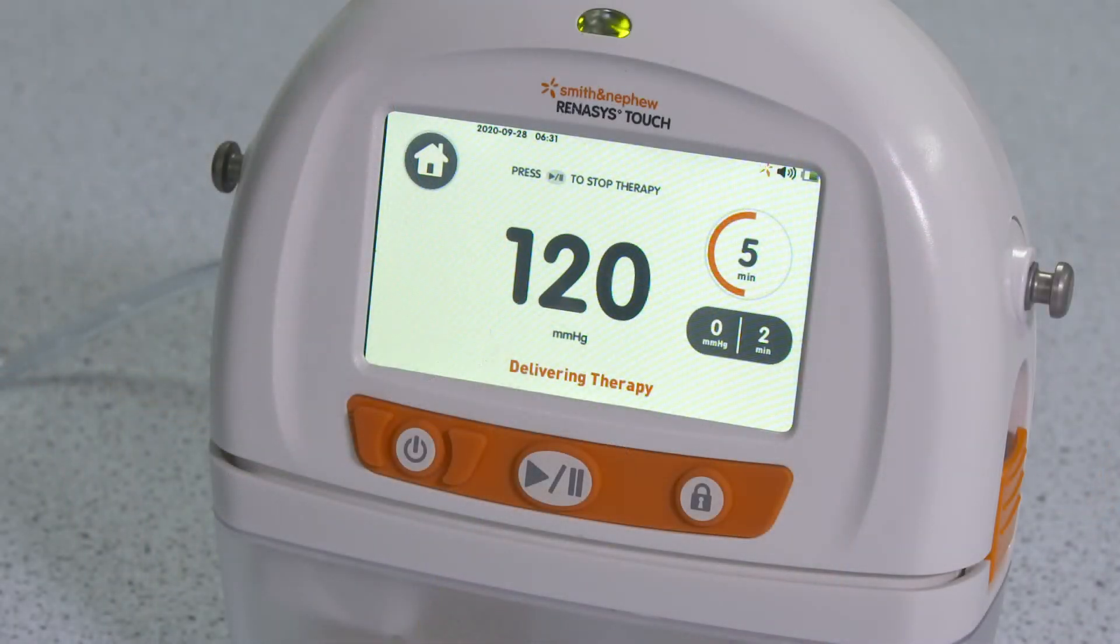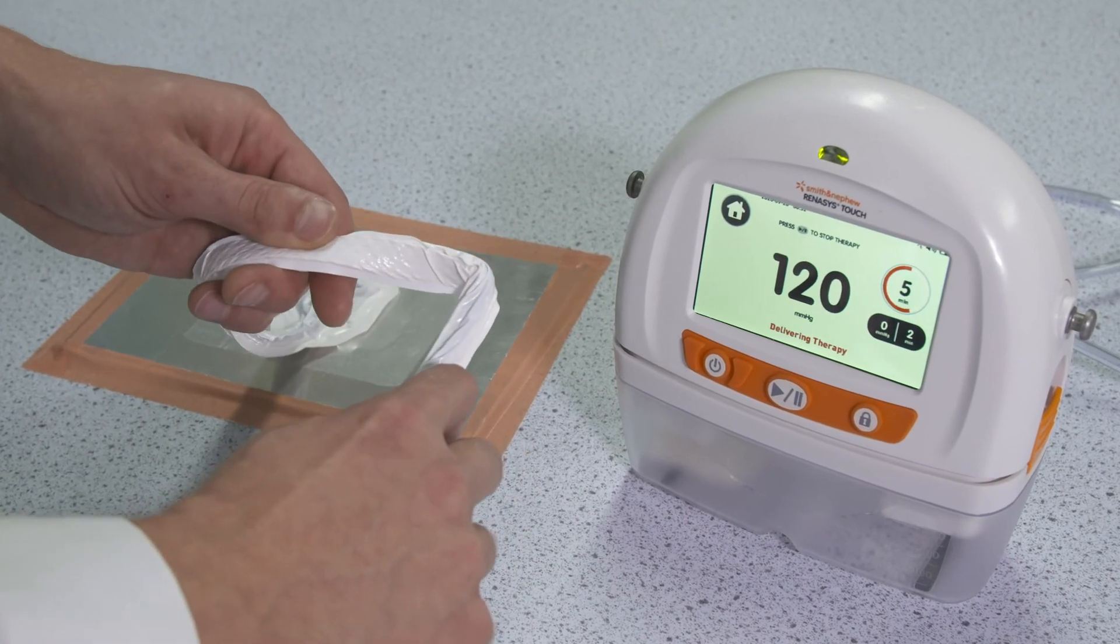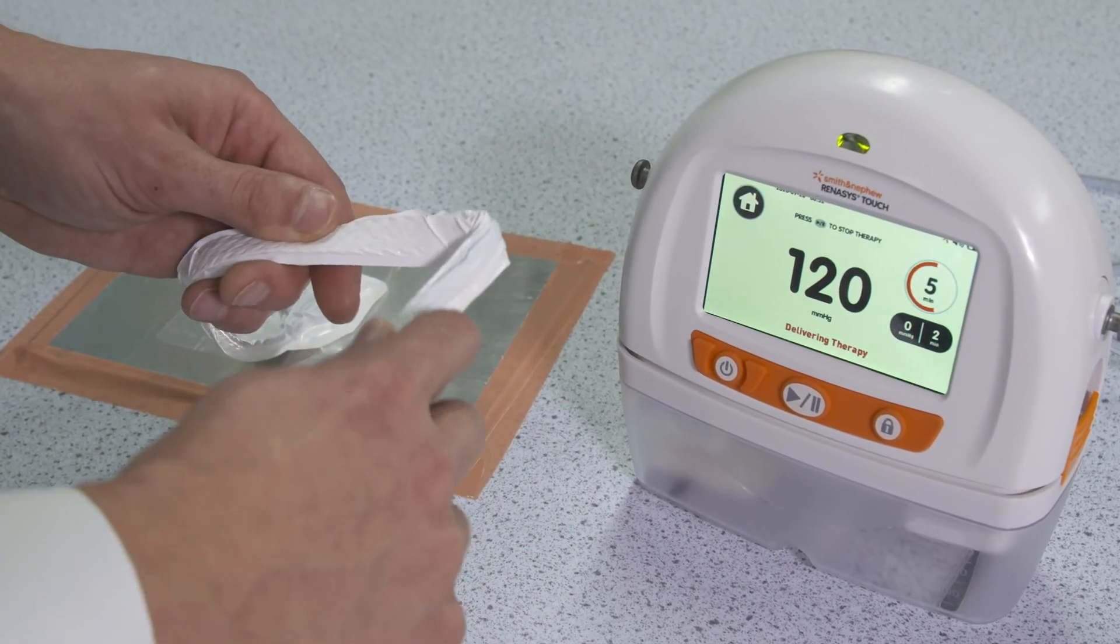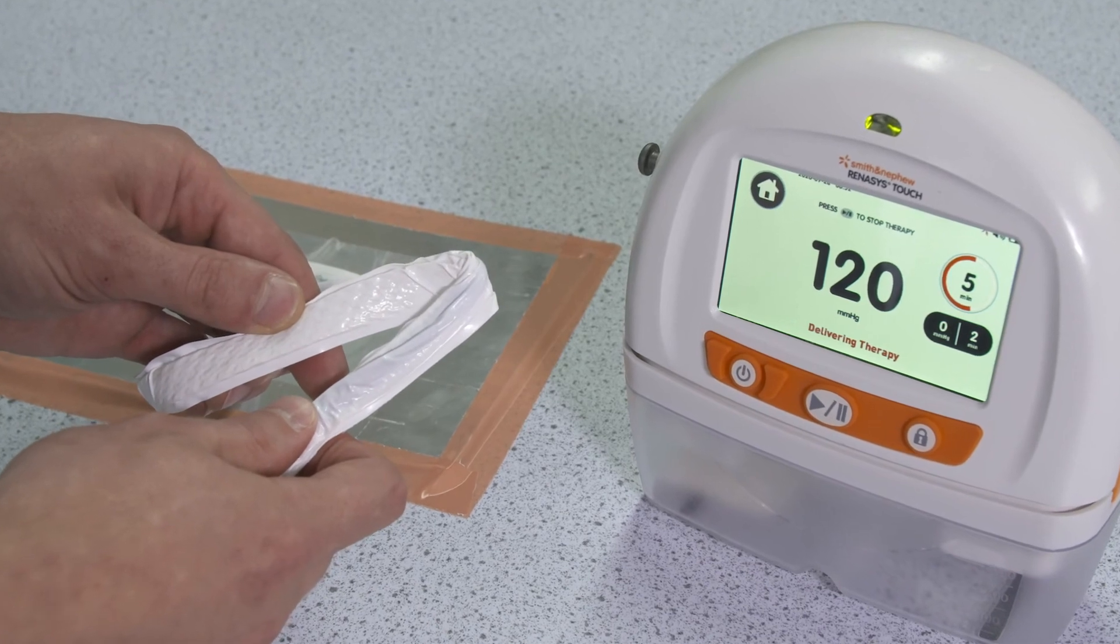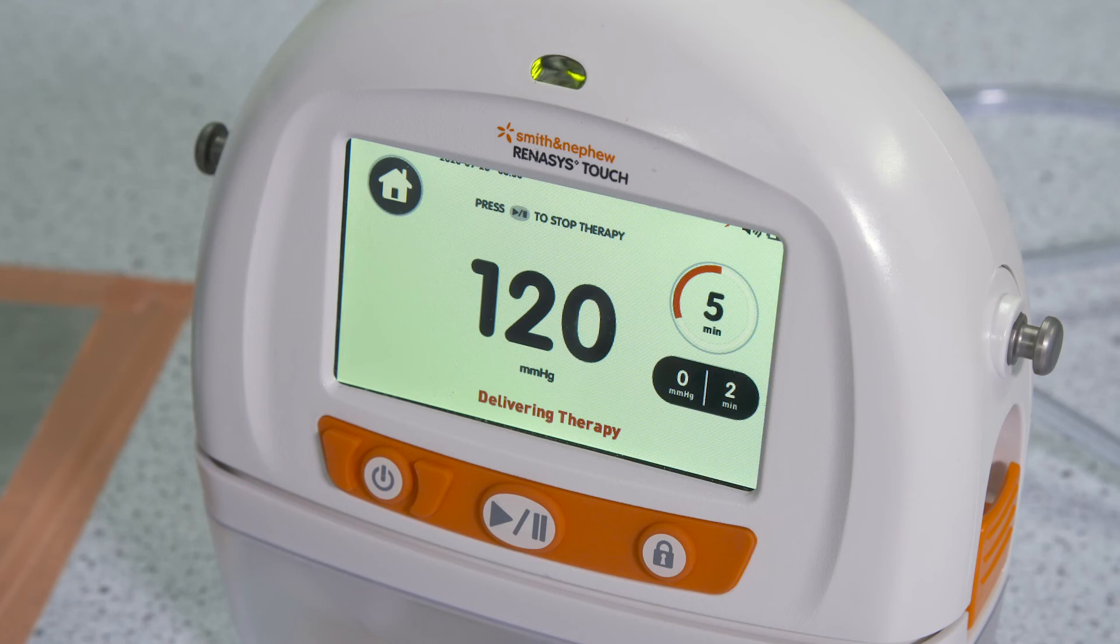The device is delivering 120 mm of mercury of negative pressure to the wound. Now we bend the flexible and conformable softport to 90 degrees and then 135 degrees. Negative pressure is still delivered to the wound. This is important, so there is no interruption to treatment.